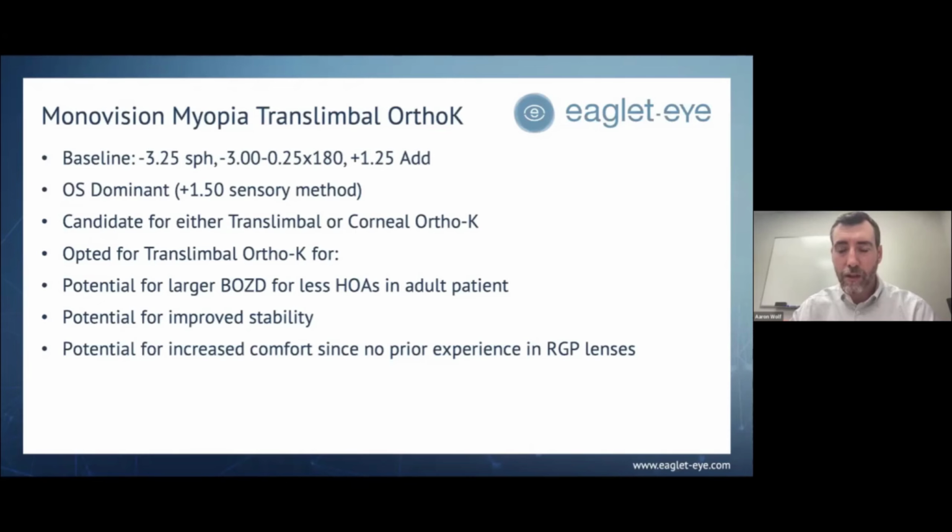The other reason is that with this patient, we really wanted to get a very high success rate early on. They had been used to wearing their lenses for a very long extended time. They were probably particularly comfortable because they probably had some corneal nerve damage as well. But ultimately, comfort was definitely never a problem for them before, right? Whether they were just very easy going, since some eyes are less sensitive than others, or they'd had some corneal nerve sensitivity issues because of the way they were wearing the lenses. The one thing that we know was never a problem for them before was comfort.